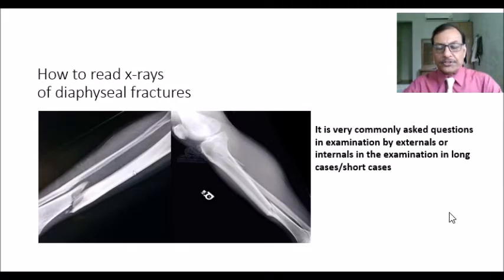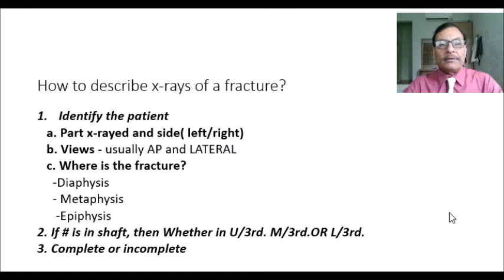We will mostly be discussing diaphyseal fractures, and these are the fractures which are commonly asked in the examination by externals or internals, especially in the long and the short cases. They will discuss the clinical findings, and they will put the X-rays on the view box and ask the students to read them. We'll see how to go ahead with it.